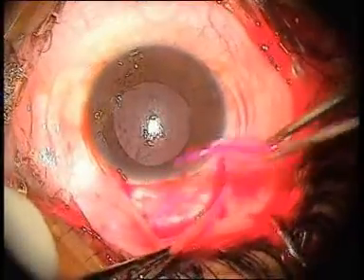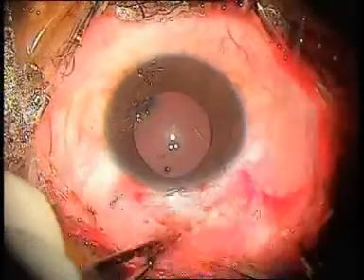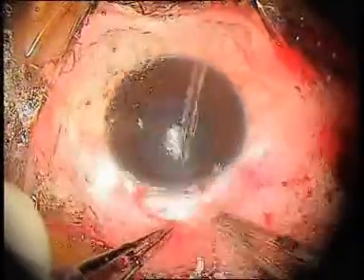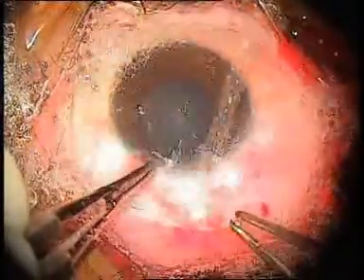Mitomycin C sponges are removed and the ocular tissues are irrigated thoroughly with balanced salt solution, which reduces the intraocular diffusion of mitomycin C.